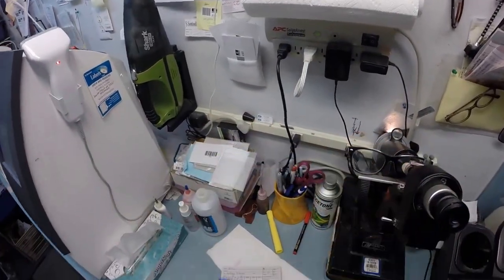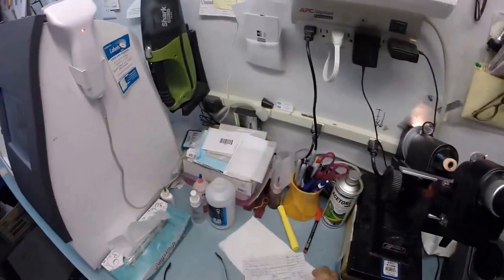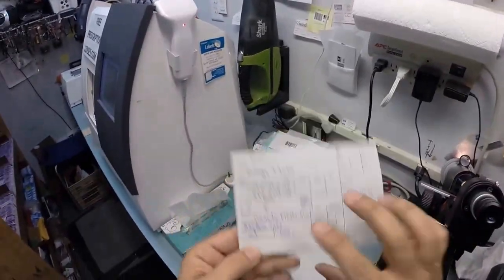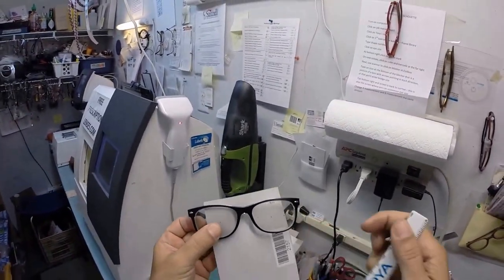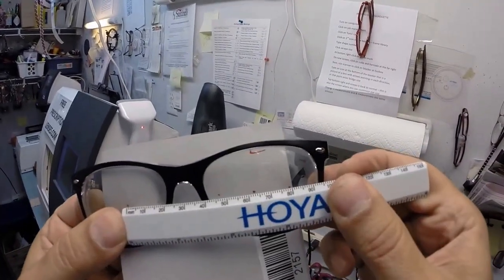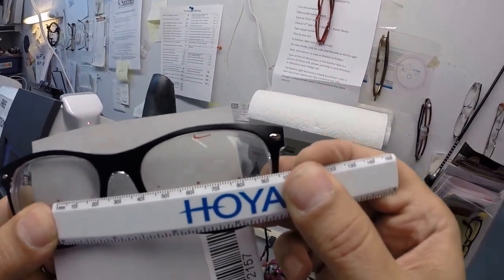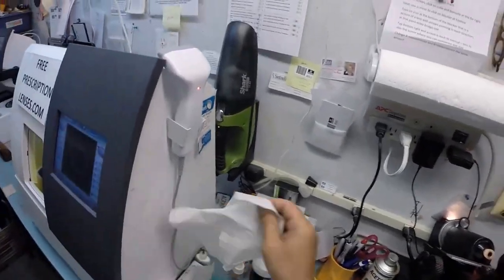If you missed any of that, let me recap - oh that's a bad joke but you'll be telling it tomorrow. Your pupillary distance is 63 millimeters. I'm gonna turn this card around. I'm gonna place the zero against my thumb on your right lens and when we look at it on your left lens we're getting 63 millimeters. So that is made perfectly. Man, this kid is good. It's my first day on the job. It's a good thing I stayed at a Holiday Inn Express last night.